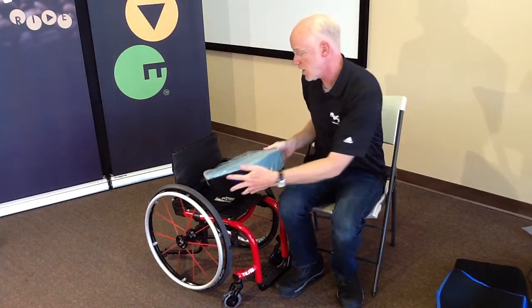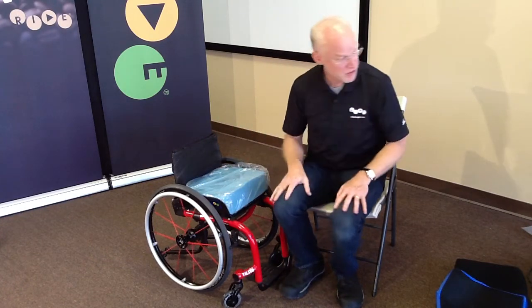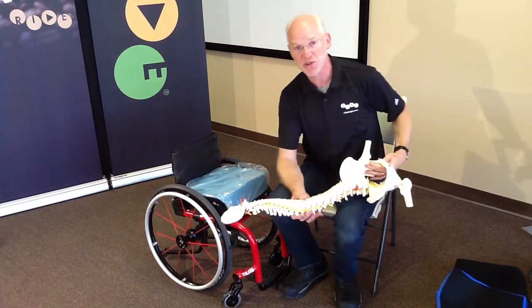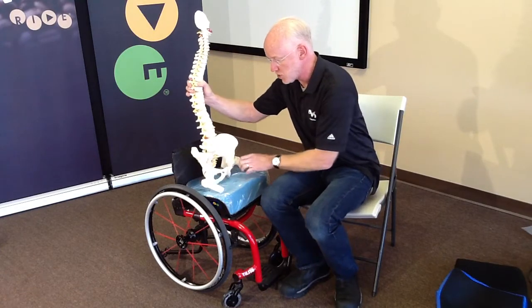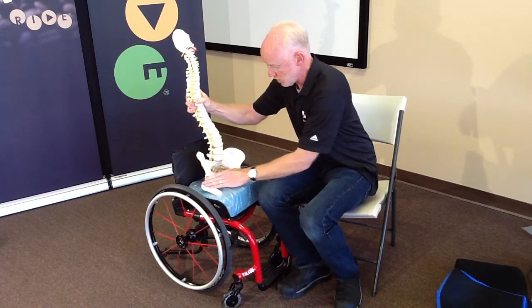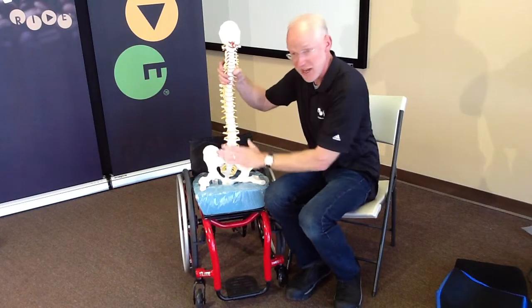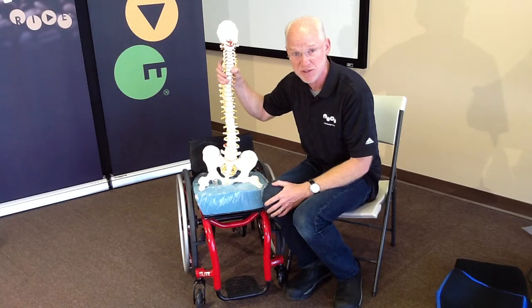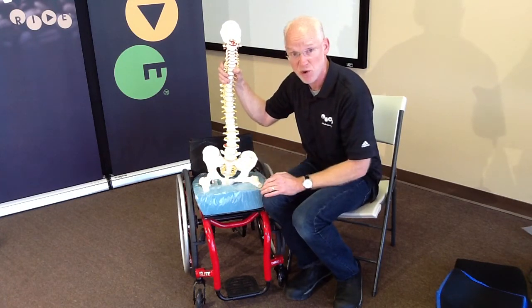This is the Ride Custom Cushion impression foam simulator. What this allows us to do, in the event that the forward cushion or Evaluator Tool don't meet the needs, is to be able to actually capture the child's shape, their buttock shape in this situation, relative to whatever the postural goal may be. Maybe the child has a pelvic obliquity and some rotation that you weren't able to take care of in the simpler devices. We can capture that unique body shape to get that postural goal met.